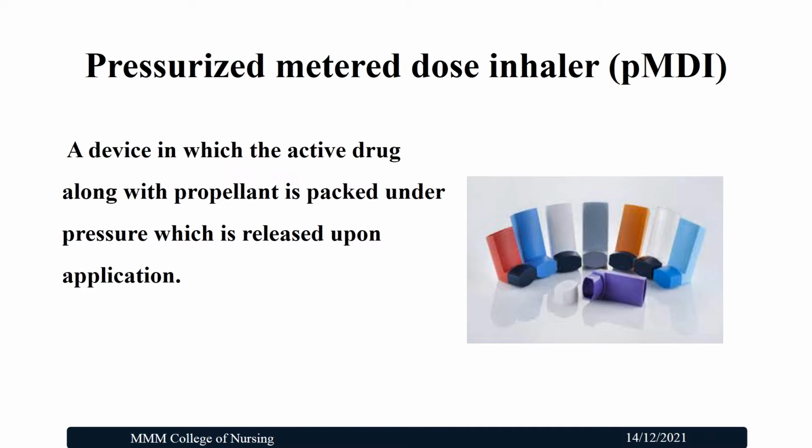Pressurized metered dose inhaler. It is a device in which the active drug along with the propellant is packed under pressure, which is released upon application.